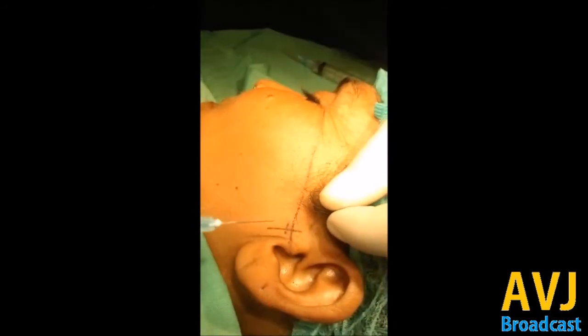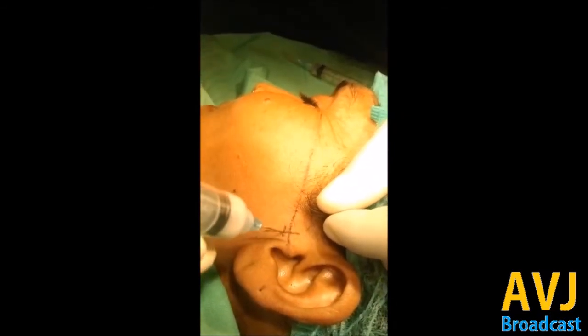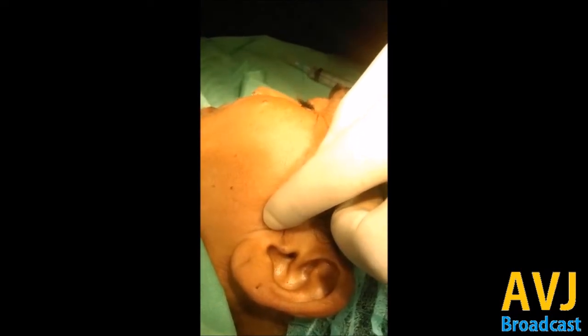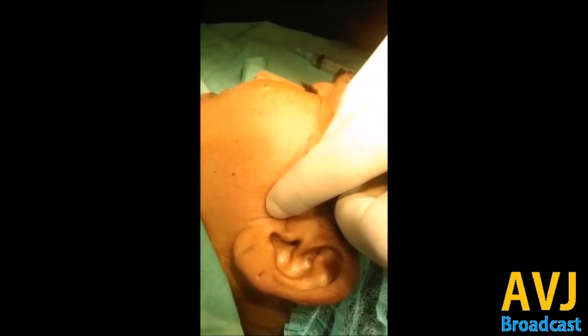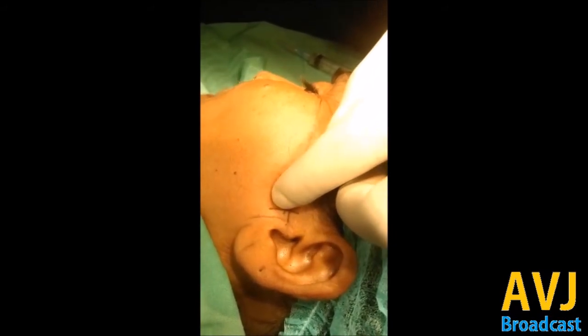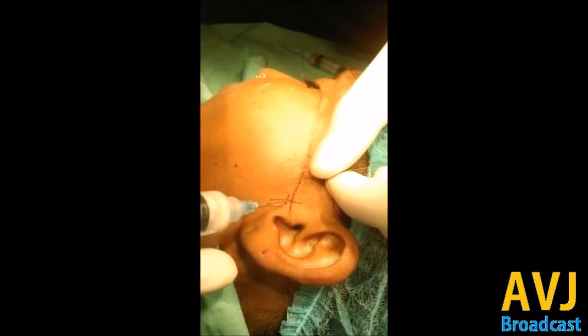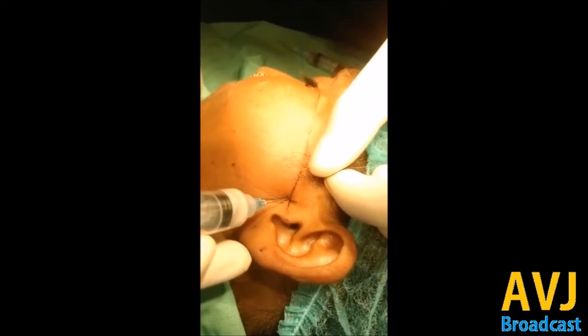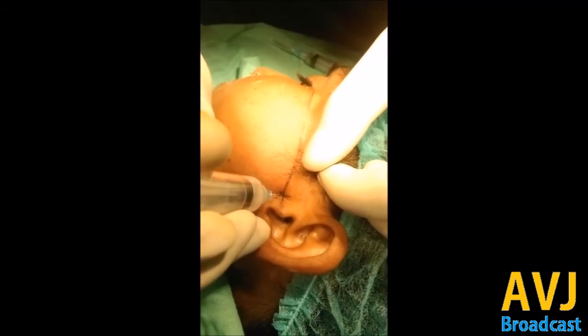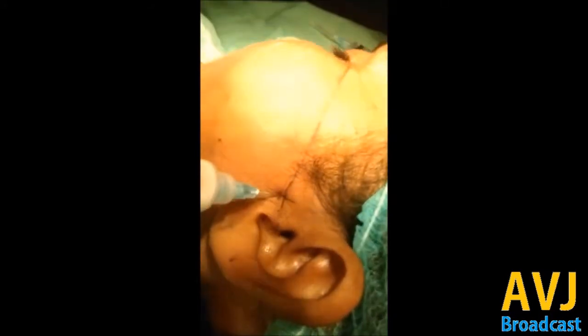Now here is a practical demonstration of the intra-articular injection inside the TMJ. First of all ask the patient to open the mouth — the mouth should be kept open until the procedure is over, otherwise it may break the needle. Hit the area 1 centimeter ahead and 2 millimeters below the line drawn from the canthus to the tragus and slowly inject it. It should go freely, and the normal resistance you feel during an infiltrate is not felt here.